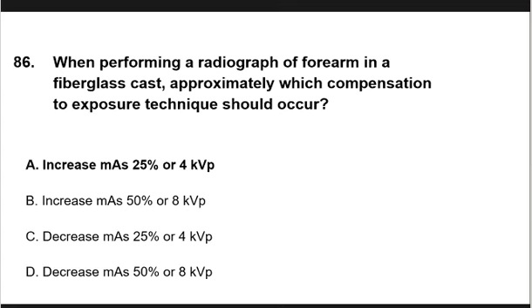So pag in-increase mo ang MAS ng 25%, hindi mo na i-increase ang kVp. Diba? Kung retain mo ang MAS and you want to increase the kVp, ilang kVp? 4 kilovoltage peak ang itataas natin, no? So either of the two. Hindi mo pwedeng i-increase pareho, pero pwede naman. Pag nag-extray tayo, wala namang nakikialam doon. So pwede tayo mag-increase ng MAS, pwede tayo mag-increase ng kVp. Pero in discussions for board examination purposes, we have to increase.